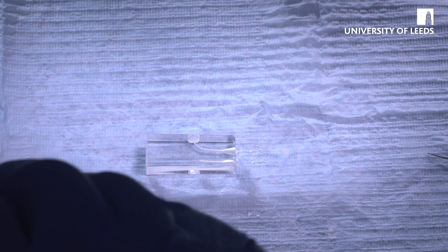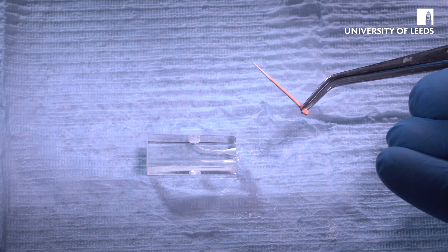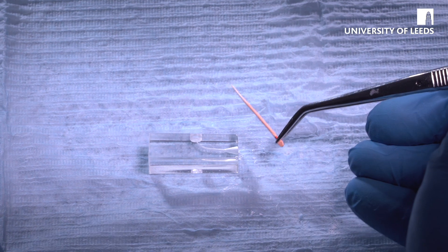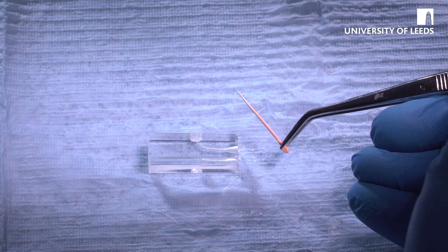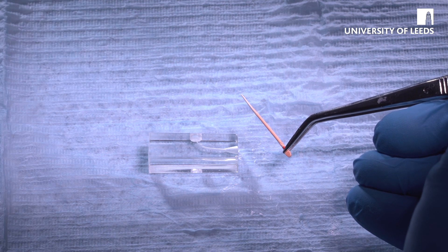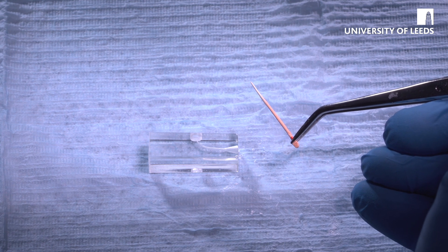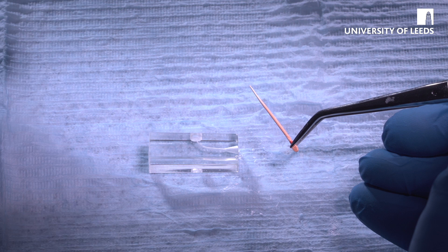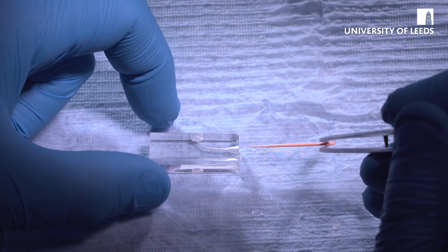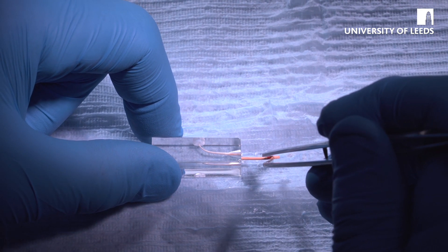A very, very small amount of sealer is what we're going to use — you're just going to lightly butter the cone with sealer. A common mistake that I see people make is to use masses and masses of sealer. You don't need that, because if you compact the gutta-percha well, you don't need a lot of sealer to fill in the voids. It's only when you don't compact the gutta-percha very well that the sealer needs to fill in a big void. So use small amounts of sealer and put that in.